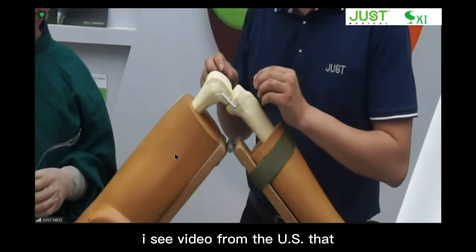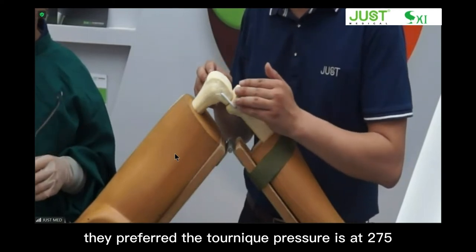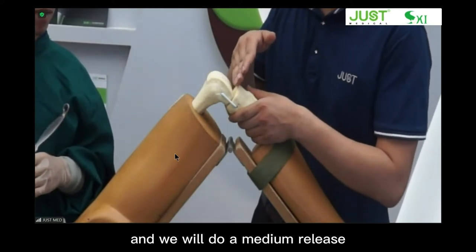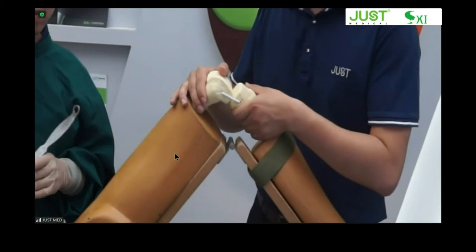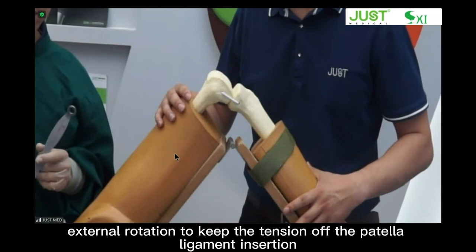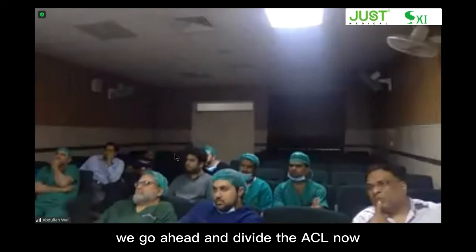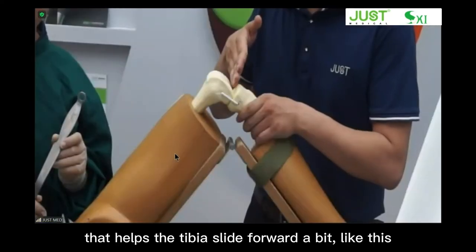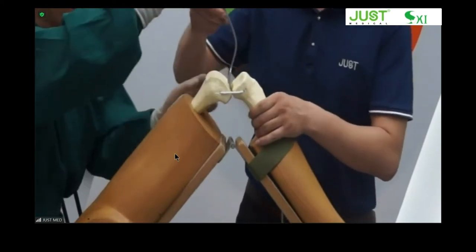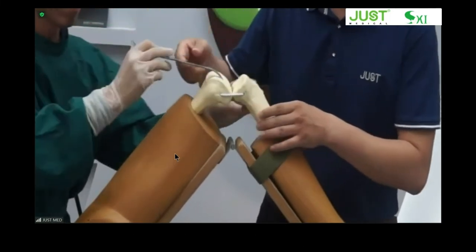I saw a video from the US that they prefer the tourniquet pressure at 275. Incise the medial meniscus, and do a medial release. Place the knee in flexion and external rotation to keep the tension off the patellar ligament insertion. We go ahead and divide the ACL now. That helps the tibia slide forward a bit, like this. We have to make the tibia slide forward a bit.